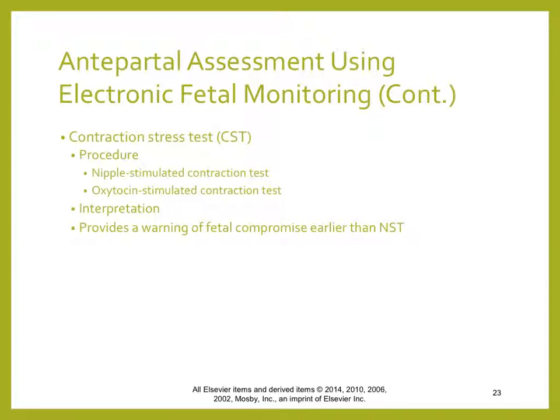A little bit more information as far as results go. The definitions of those results are on page 265, table 10-5, and they are just as extremely important as the NST, because I said you guys will see these again. Probably for me, probably for state boards. And you need to understand it and make sure that you don't confuse the results in the test. So we're going to look at a couple of strips to actually put the verbiage together with the strip.